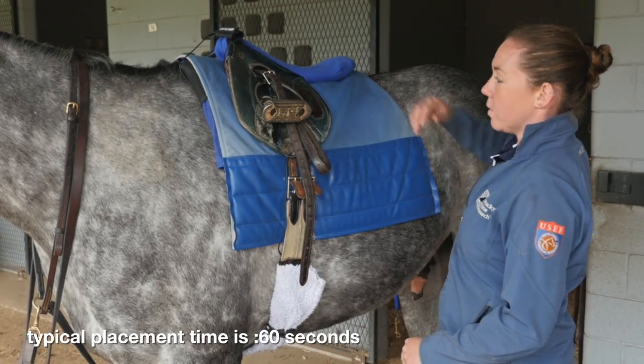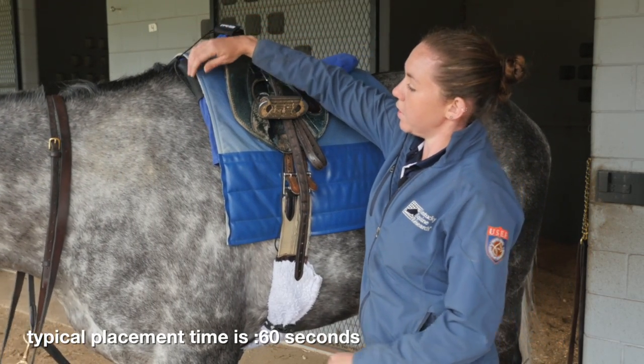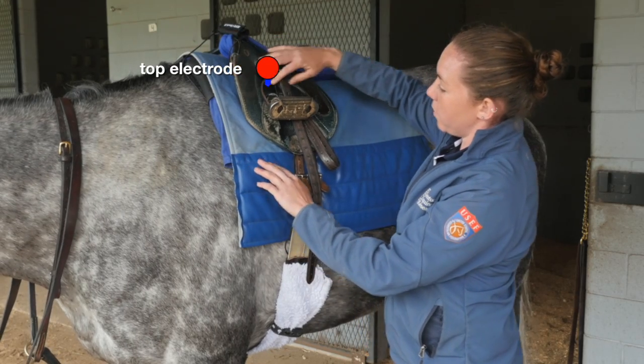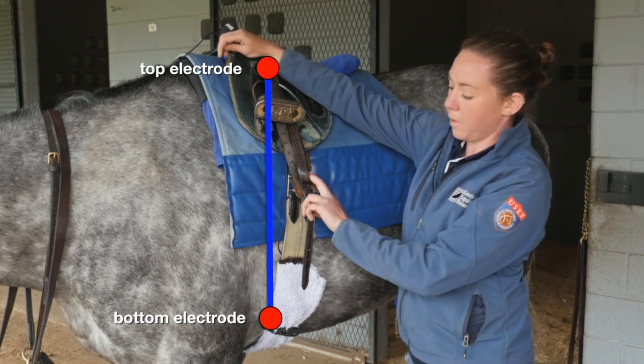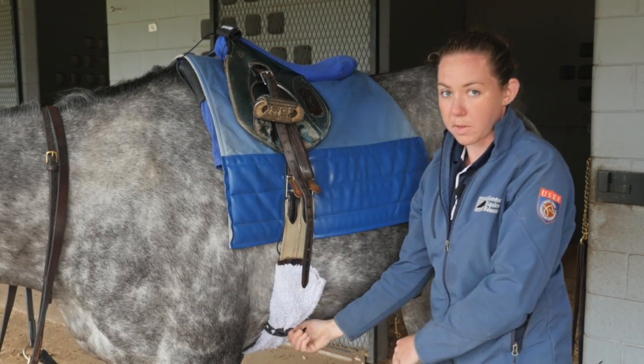In review, we have the transmitter up here, and the top electrode is going to be under everything — under the saddle pad and the saddle — pretty much right here under the saddle where the weight of the rider will be on it. Then the bottom electrode comes down under the saddle and connects to the girth here with the rubber around the girth.